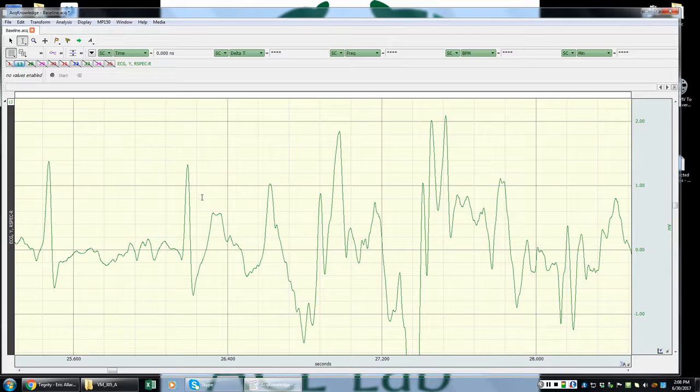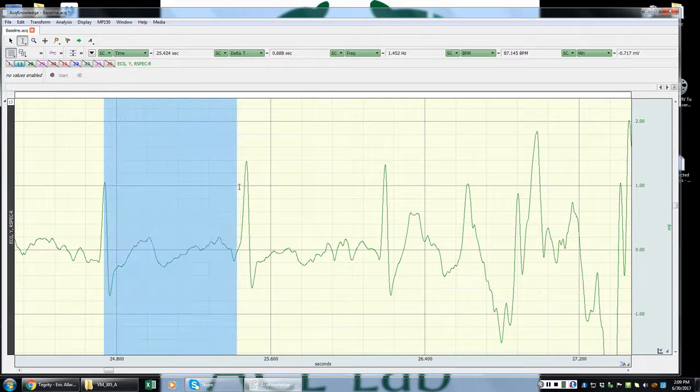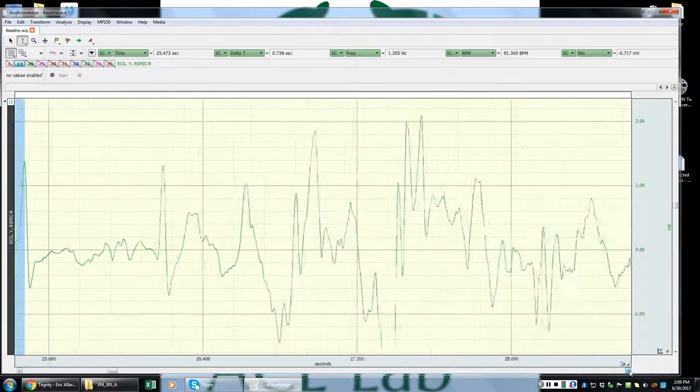Now, in order to make this determination officially, I need to look at the distance between peaks. So I'll look at the distance between the two most recent clean peaks, put my I-beam tool here, and look at that interbeat interval between these two. I'll look up here and it says about 0.724 seconds, so that's what I'm using as my benchmark. I can even go back a little bit further and look at the distance between these two peaks, and it's about 0.738, roughly the same, between 0.72 and 0.74.